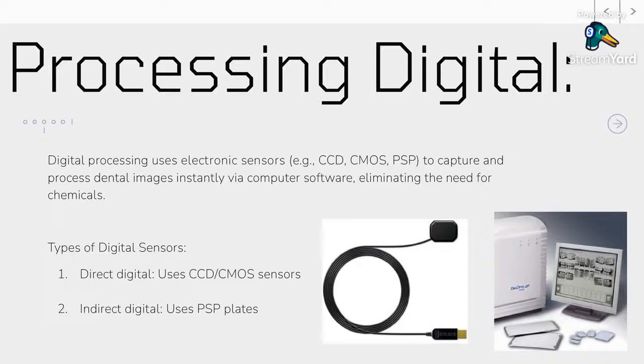In addition, we need to connect it to the computer and the sensors are scanned after the exposure. Very easy for us, very convenient for us. Most even the tertiary cares have sensor units with them, digital processing instead of manual processing. Hopefully, manual processing will go obsolete because I personally am not a fan of that.